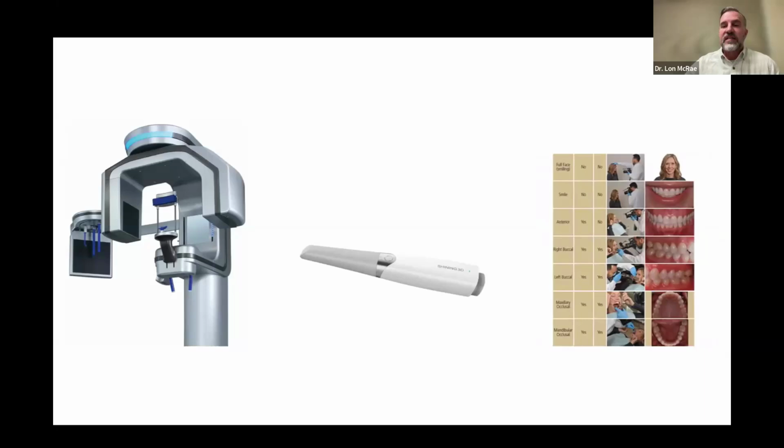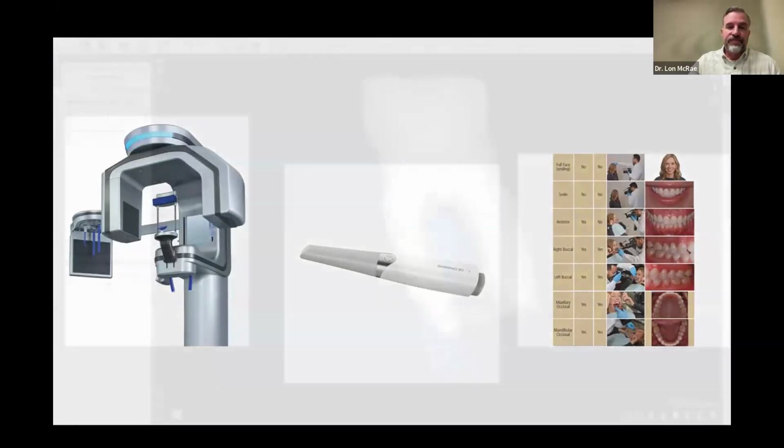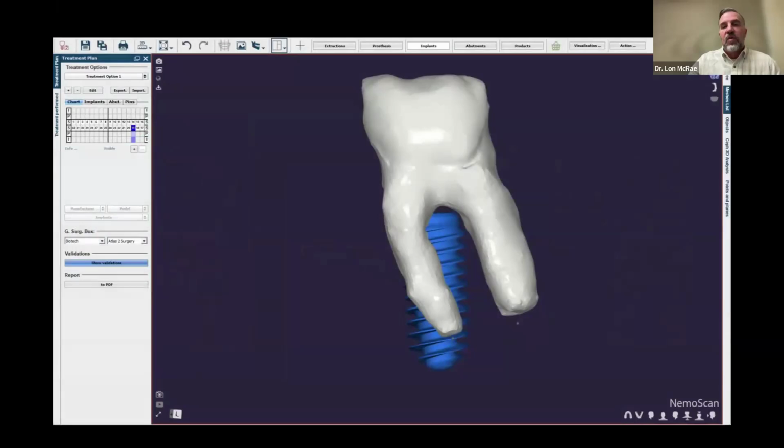We always take a series of photographs. Those photographs then go to the designers as well. They get a lot of information just from the photographs, and these are the series that we take. And now it's to the point that my surgical assistants are doing all of this work when we are setting up a patient to do it. And we literally call it the all-in method. So what is unique about the all-in method?